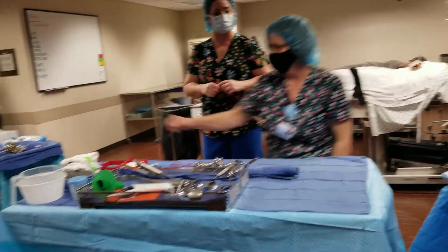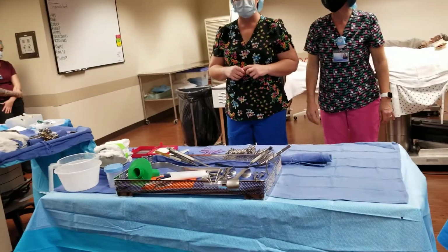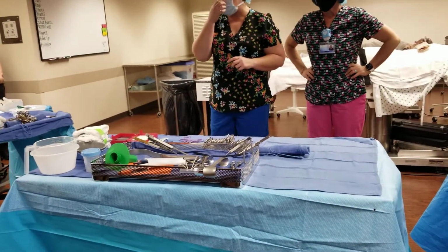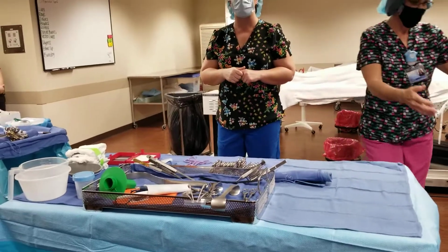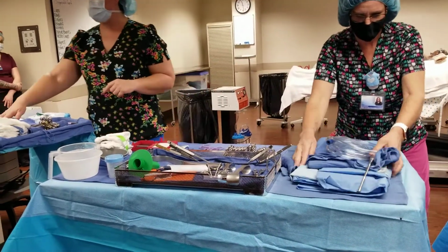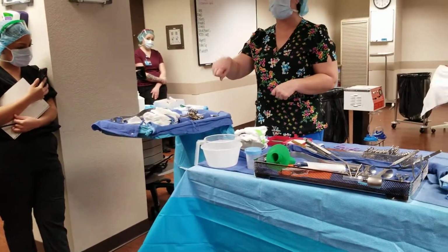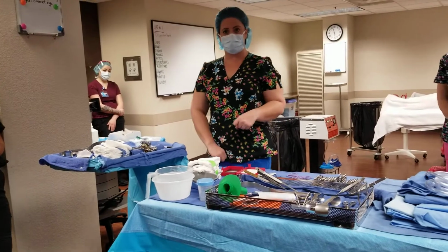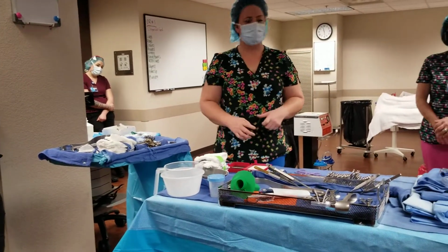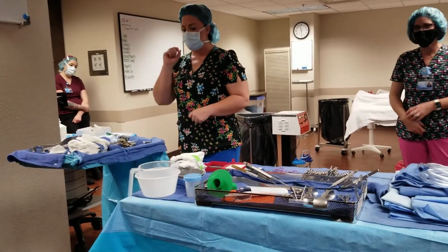We don't have three Deavers? I mean, bladder blade? No, we just have the two. Okay, and the other trays. Typically the C-section set will have a bladder blade, and that's what you want up. You might also want some Army-Navies or Goulets as they're dissecting down. As soon as they get in, the bladder blade goes inferiorly, at the bottom.